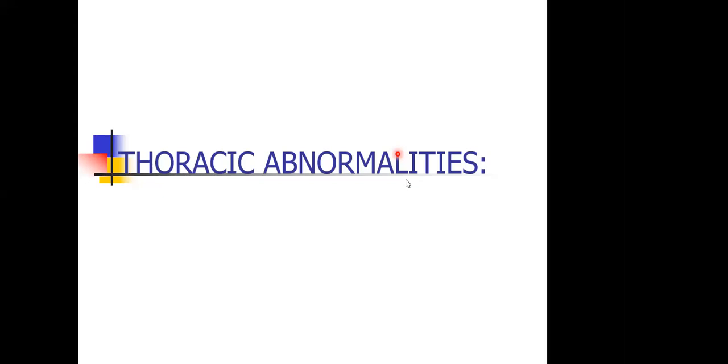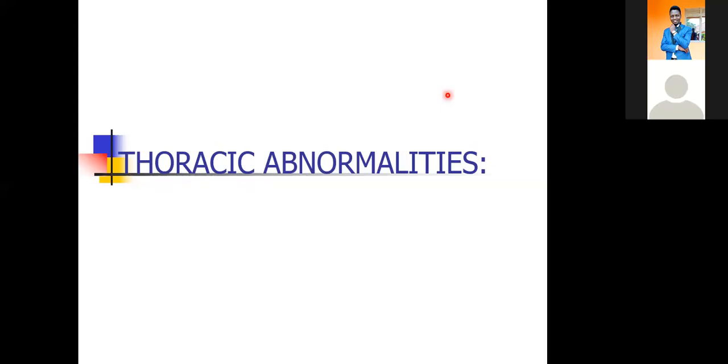So when we were talking about explaining ventilation perfusion scans or the VQ scans, we explained that the patient is scanned twice.